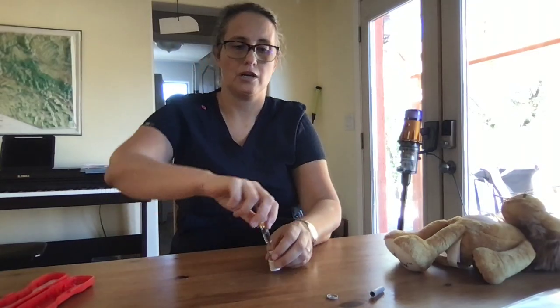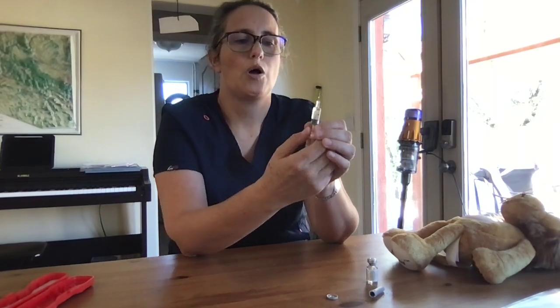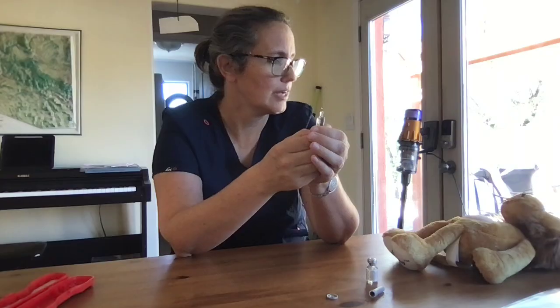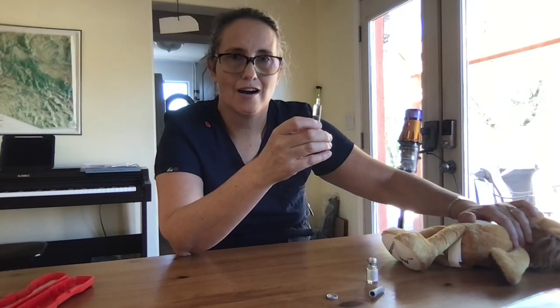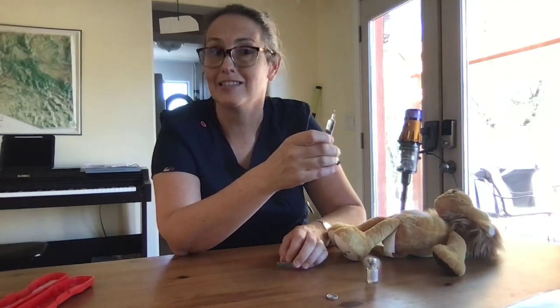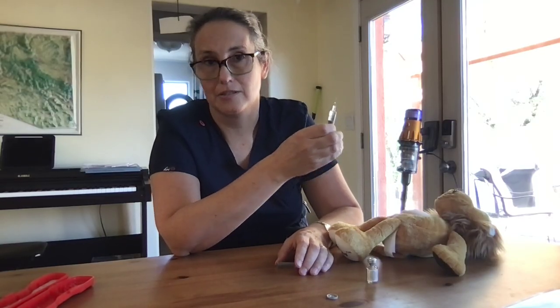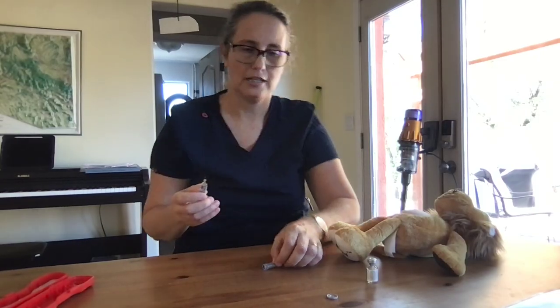We're going to take the needle out of the vial, and we are now ready for administration. I'm going to use an administration doll for this purpose, but for you out on the field trip, you are going to use the student's leg. We are injecting into muscle, and most students have well-developed muscles. Your nurse will tell you if you have a situation where you're going to give that shot in a different area.